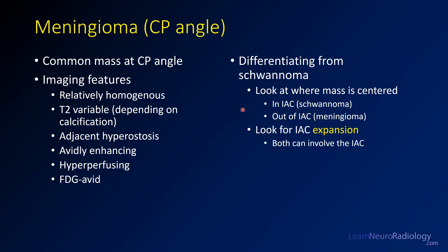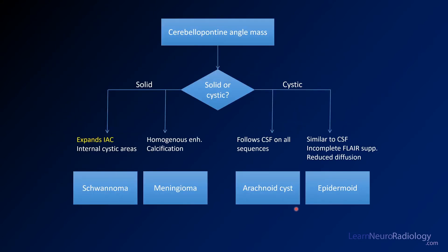In many cases you'll be trying to differentiate this from a schwannoma. The best feature is where the mass is centered: if it's in the internal auditory canal (IAC), it's likely a schwannoma; if it's outside the IAC, it's likely a meningioma. Look for expansion of the IAC, because both can involve it, as is the case here.